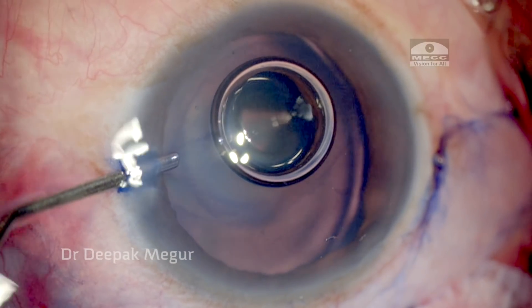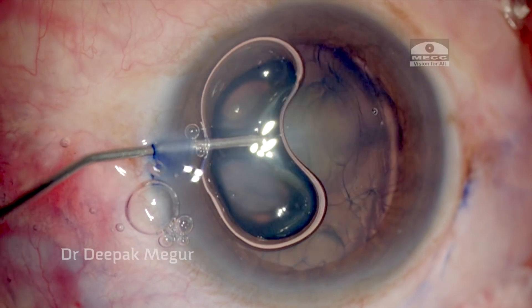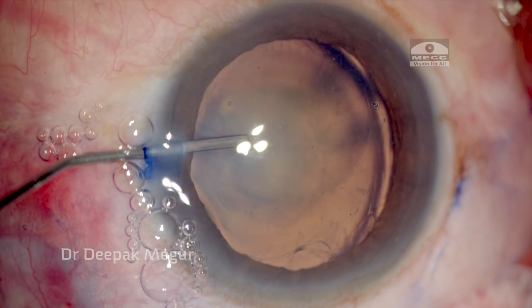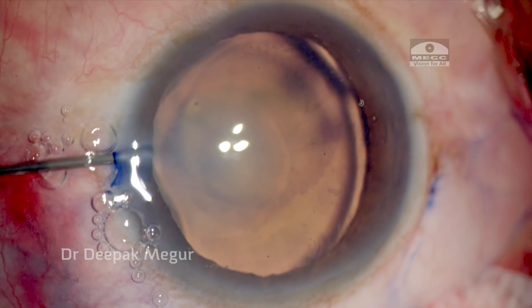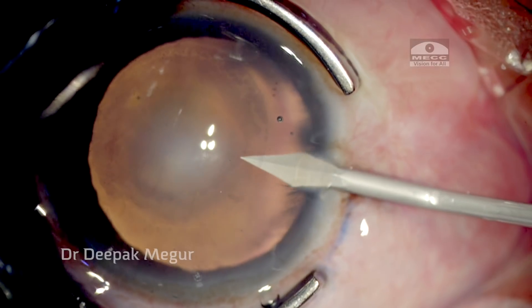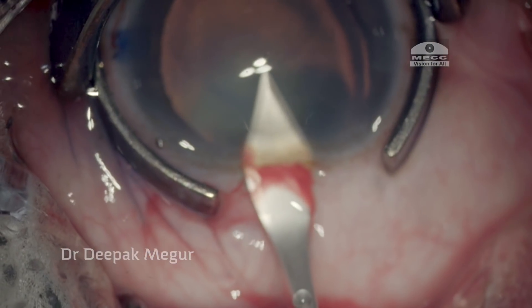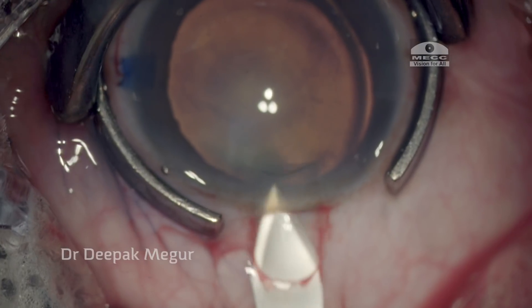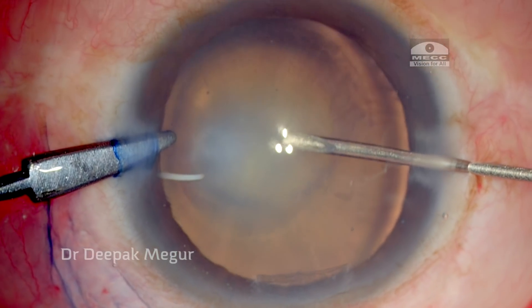After studying the capsule, I want to tamponade the area of zonular weakness by using a dispersive OVD. The idea is to ensure we tamponade that area and prevent herniation of the vitreous coming through the area of zonular dehiscence. Then we make the main incision.